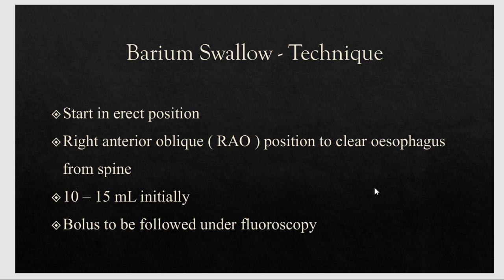Usually in barium swallow, the investigation starts in the erect position for the patient, and to clear the esophagus from the spine, usually the right anterior oblique position is preferred.